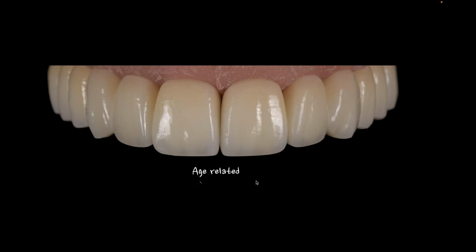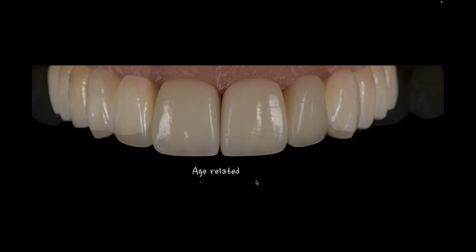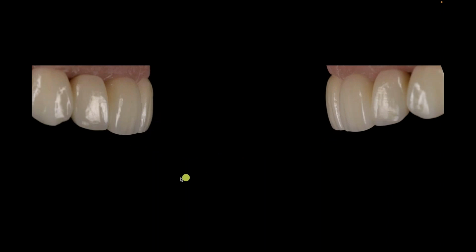Obviously you needed more implants for this. We have to have 8 implants instead of 4 or 6, 2 more implants, but it really is a nice way to manage the cases, I think, for me. There's the final restoration. You can see surface topography, some little wear and chipping on the cuspid, so it looks a little bit more real. And this is on the pink tissue model. And then we'll bring this to the mouth.